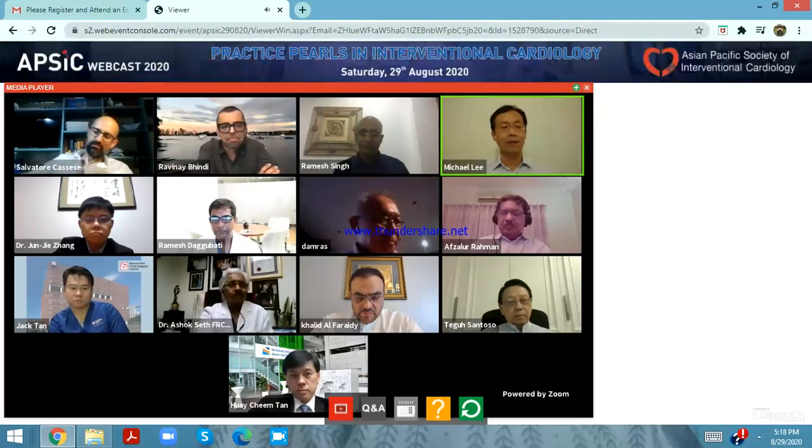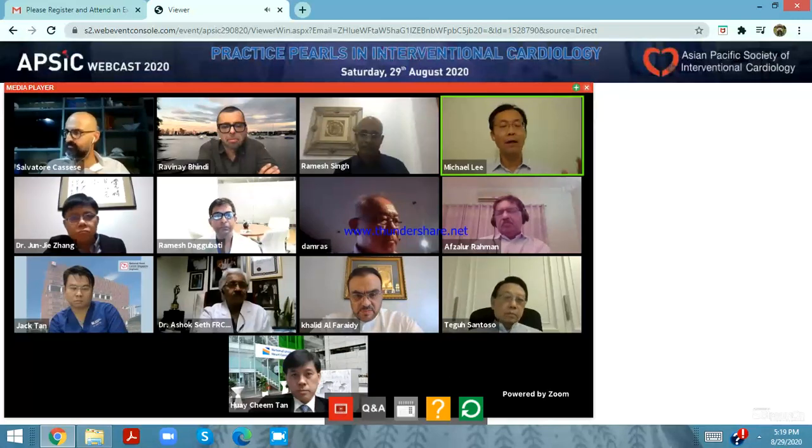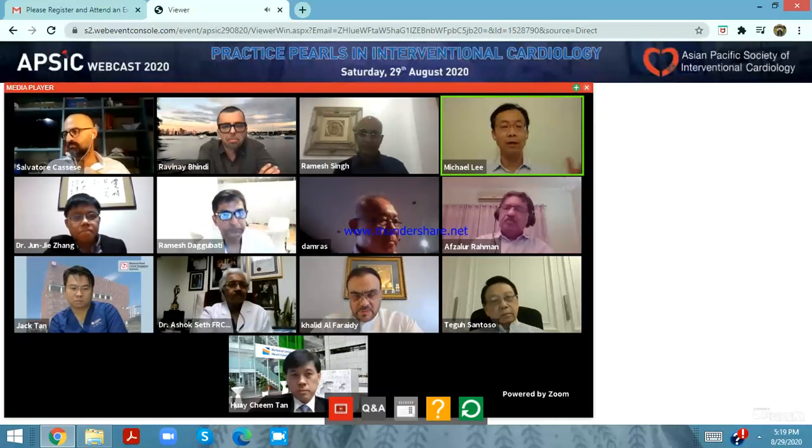Like if we see just a moderate or a very mildly calcified lesion, not to the degree of 180 degrees arc, of very, very thin calcium, then we can simply use an ordinary NC balloon or scoring balloon instead of the shockwave balloon. Sometimes it might be a cost saving for us.